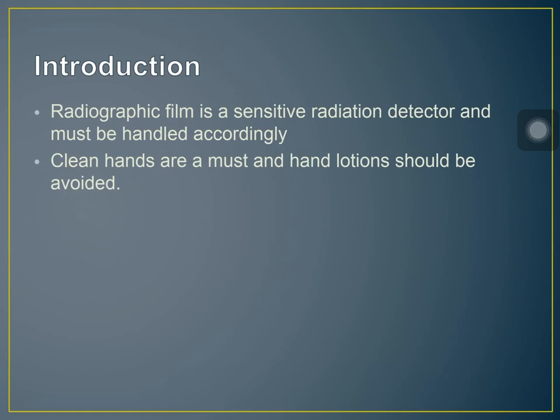Why do you think hand lotions should be avoided for handling a film? Kasi di ba kapag may lotion yung kamay natin, sometimes it's sticky. And that stickiness can be attached on your film. Mag-iiwan siya ng fingerprint mark, ng thumb mark. Once na dinevelop nyo yon at nag-leave ng fingerprints on your film, makikita yun.